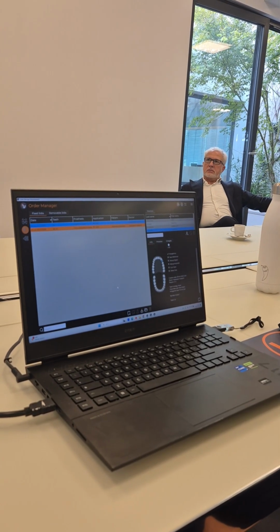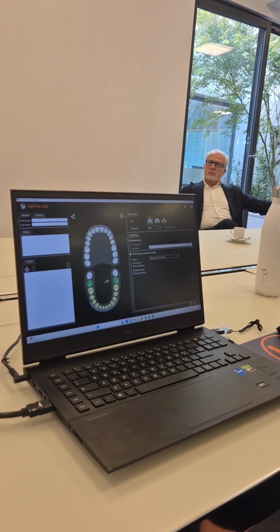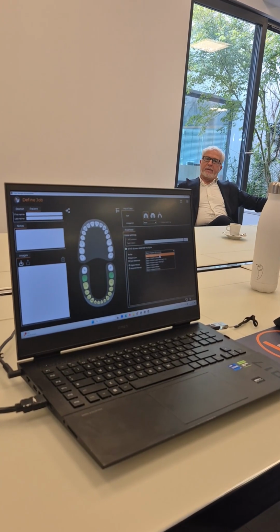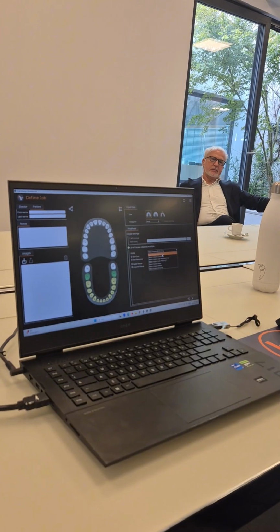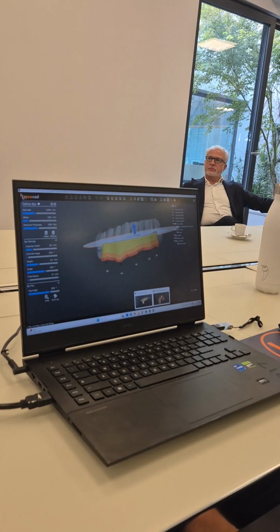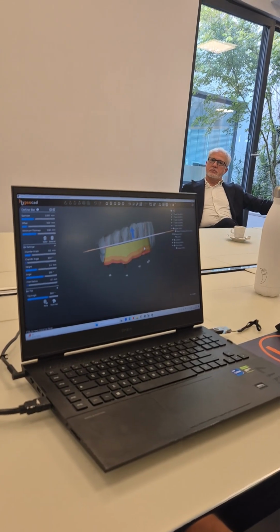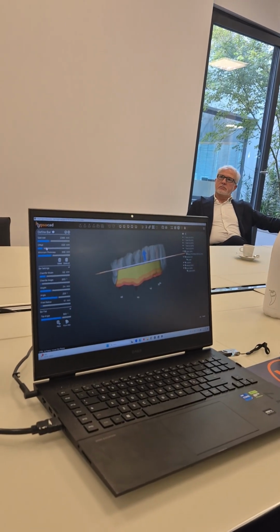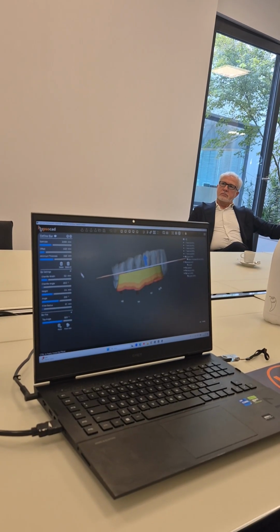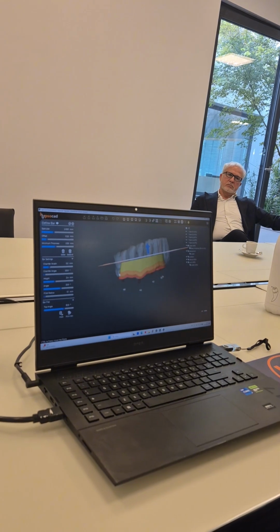It's automatic. Why? Because in the defined job, when you select the correct material, automatically you have a setting for the bar, for the zirconia, for the laser melting, for the milling. You have parameters automatically. For example, in this case, this is for the milling bar. Automatically we have 0.20 millimeters for the cementum gap. Of course, you can modify these parameters. But there is the extra compensation.